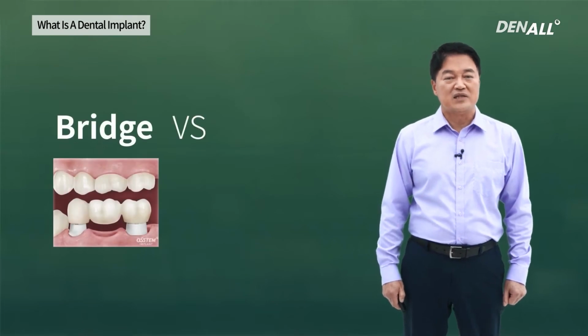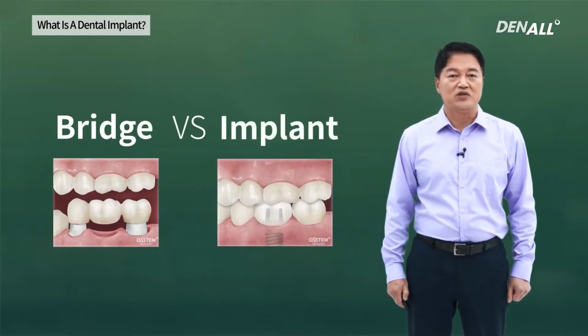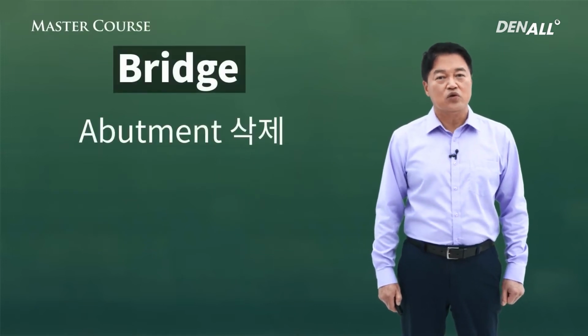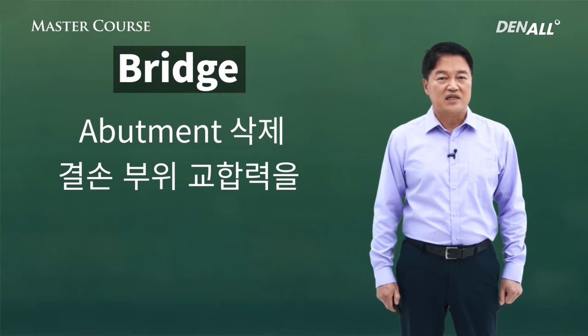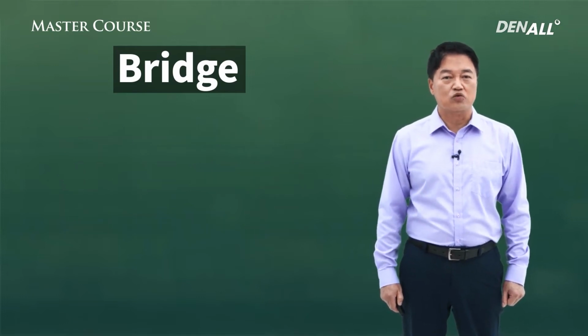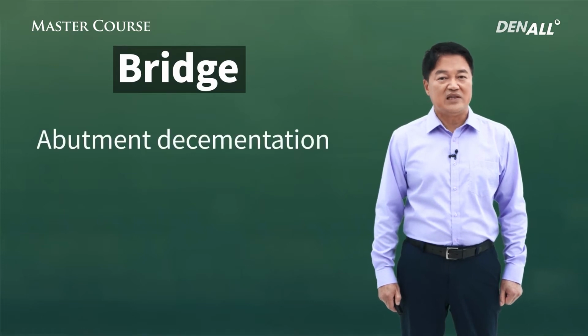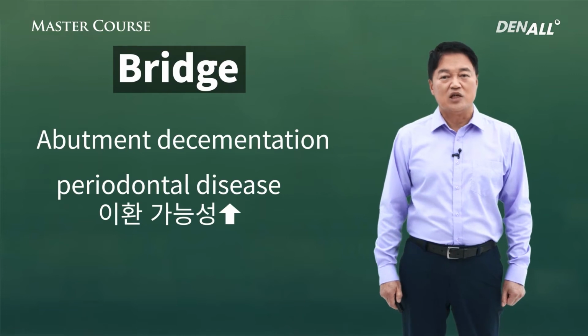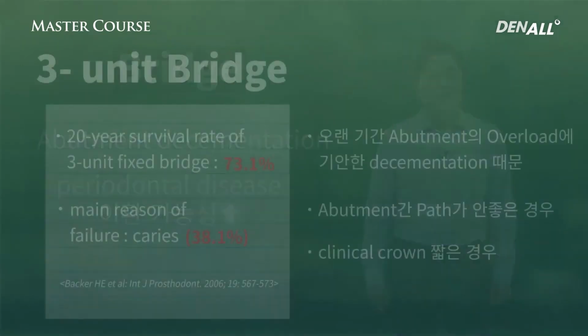The bridge and implant, let's compare the two. For the bridge, you need to prep the abutment, and the occlusal force goes to the abutment. If you use it for a long time, decementation of the abutment can occur as well as periodontitis.